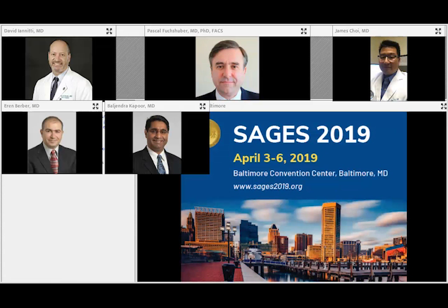Yeah, I mean, look, obviously we're talking about biology of disease. And so I agree with Dr. Berber's comment. You start getting above 4 centimeters or 5 centimeters, I think you need to add some other therapies. However, I'll go ahead and tell you, we've ablated things 15 centimeters. Those are unusual and specific circumstances in which we do things like that. But again, with microwave technology, there are no limits to what you can ablate. So the question is, what should you ablate?